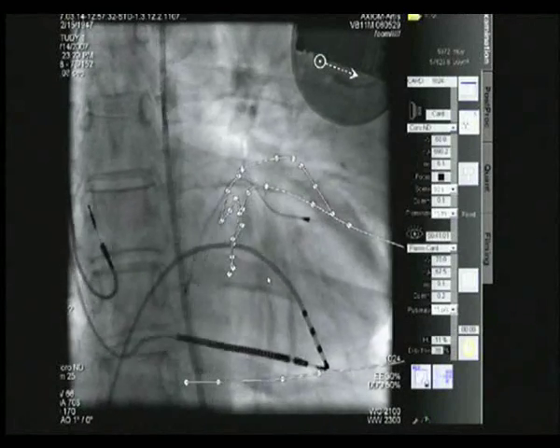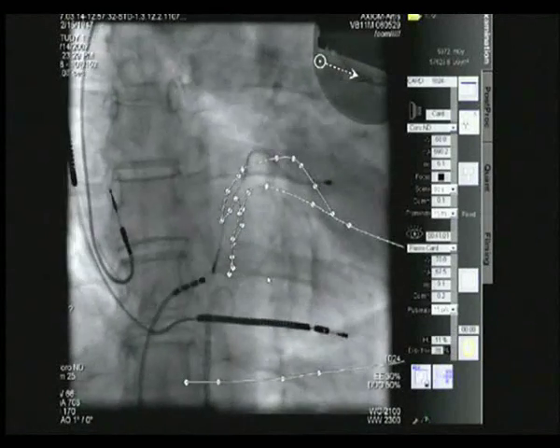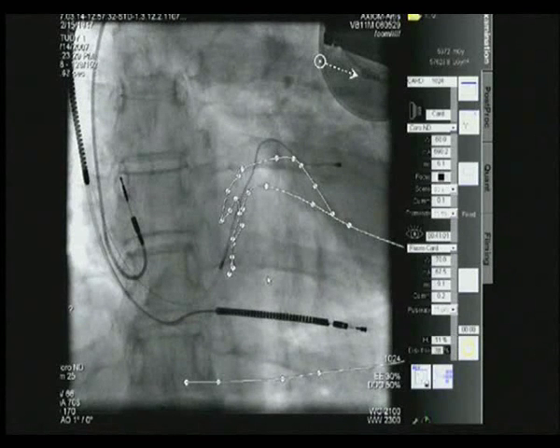The conductance catheter and the temporary right ventricular catheter are both retracted from the ventricles. The implantation can now be finalized.